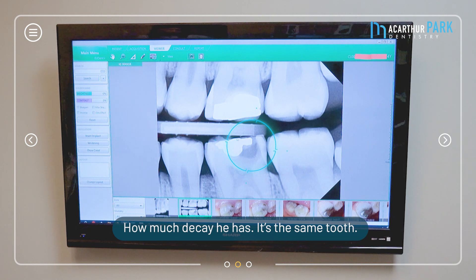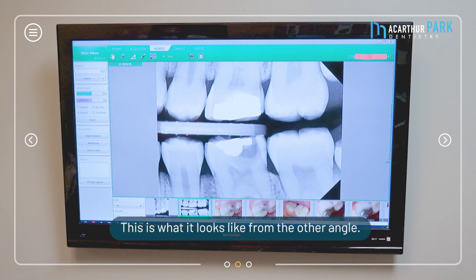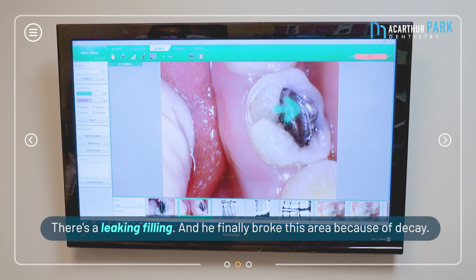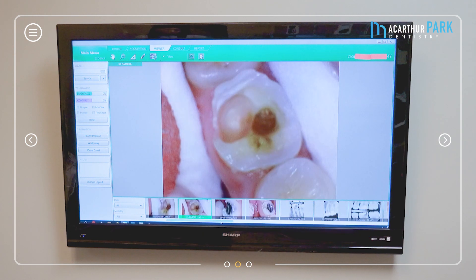The same tooth — the little decay grew much bigger. After I removed everything, look at this from another angle: look at how much decay is sitting here, and look at this leaking filling right there. The filling was leaking, and he finally broke this area because the decay grew back, the tooth got really thin, and it finally broke — that's what brought him in.